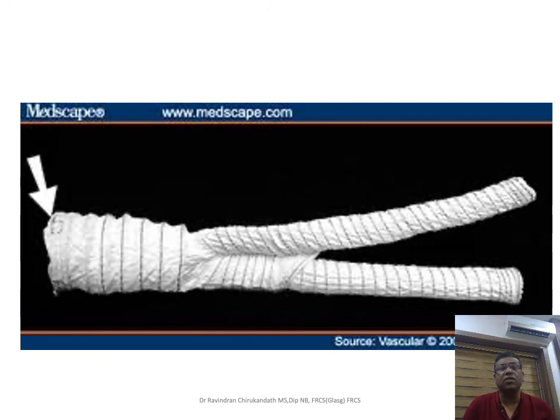So I think any instrument or anything can be kept for you on the instrument side, which you have studied over the years. Orthopedic instruments are also kept. I've just scanned through a few instruments, tubes, specimens, operative surgery and x-rays, but the basic idea is to look into your theory which you have learned over time, and then describe it as the questions arise. It is not to be learned by heart. All you need is to familiarize yourself with what sort of things can come to you, and I'm sure you all will do well.